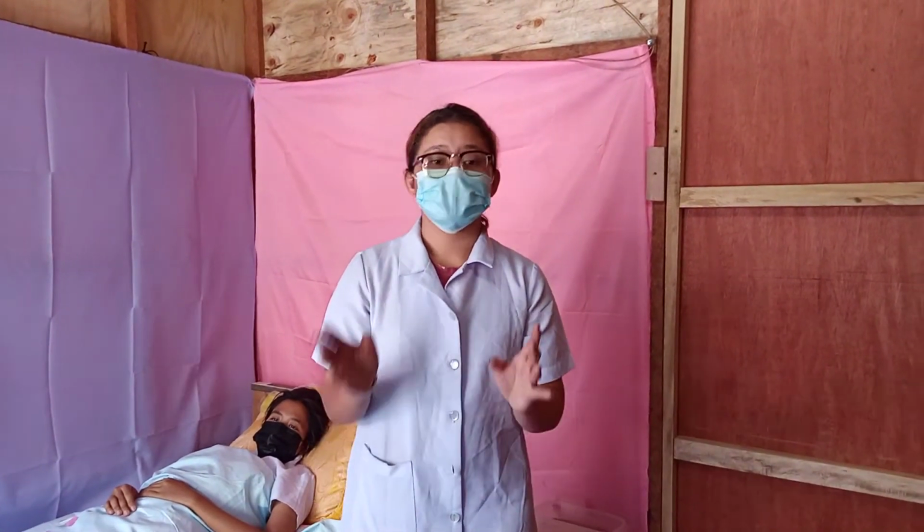Position the arm at the level of the heart with the palm of the hand facing up, preferably using the left arm because it is nearer the heart.